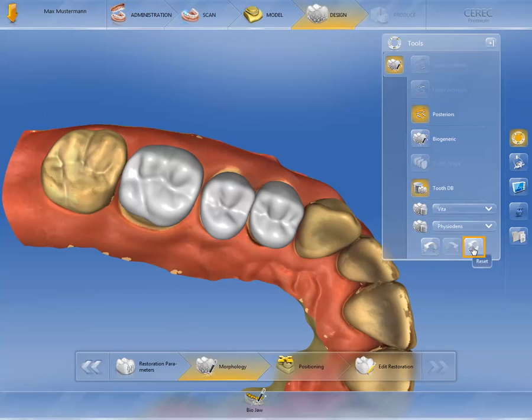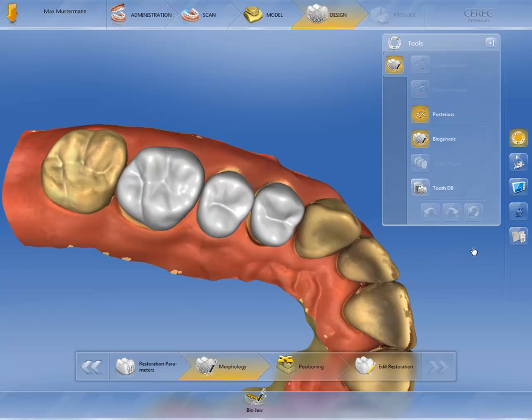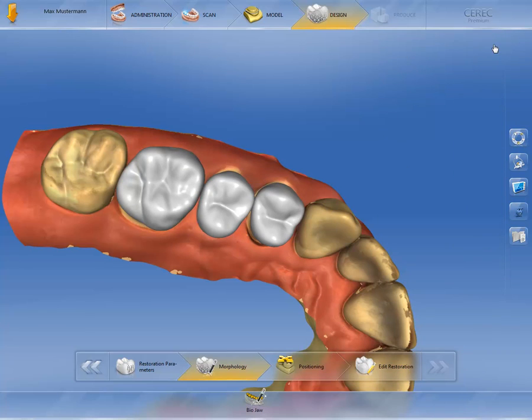In our example, we stay with the biogeneric morphology in order to show you all the advantages of CEREC Premium, and are now proceeding to the next step. In the positioning step, you can change the positioning of the restoration.